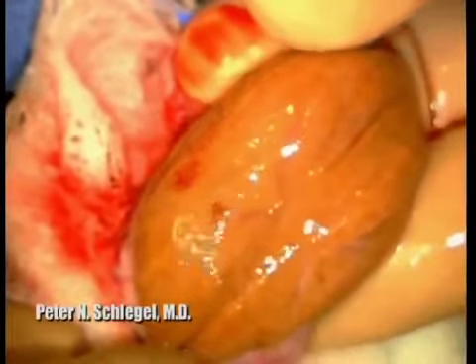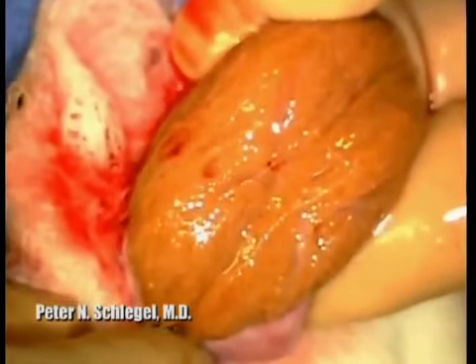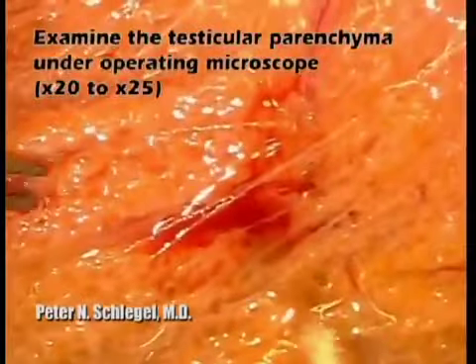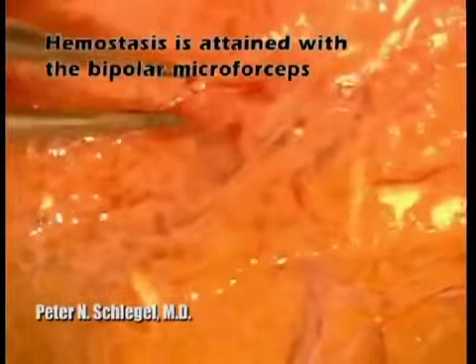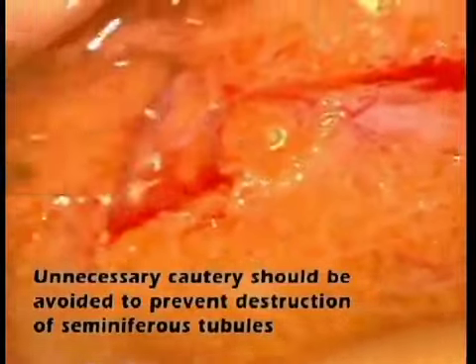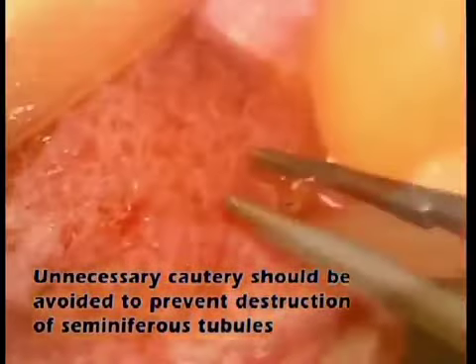After dividing the tunica albuginea along an equatorial, relatively avascular plane, the testicular tissue is everted and the seminiferous tubules are examined under the operating microscope. Hemostasis is attained with bipolar microforceps. Unnecessary cautery should be avoided to prevent destruction of tubules.